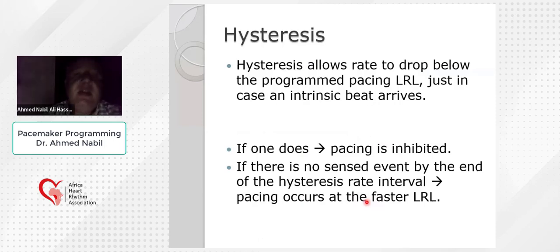Also, hysteresis is a very important option or programmable parameter in the pacemaker because it allows the rate to drop below the programmed pacing lower rate interval to promote any intrinsic activity that can occur and promote this intrinsic pacing. Sorry, this intrinsic activity or these intrinsic beats.